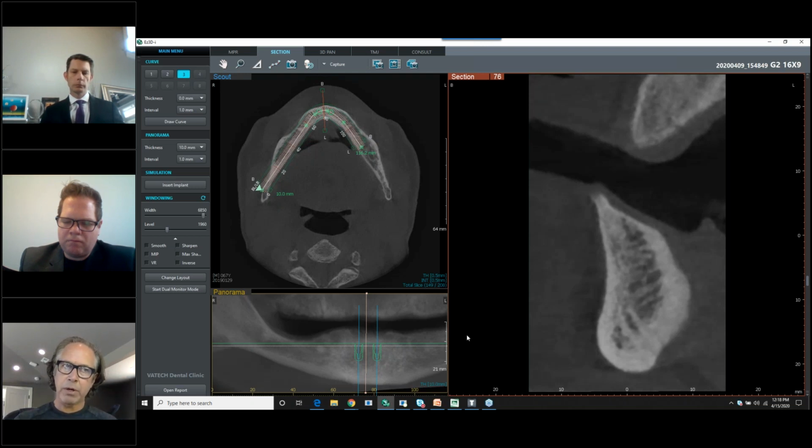I'm sure you have, because I have too, been in a situation where the patient says, Doc, when I bite here, it snaps up in the front, or if I bite in the back, this side, it snaps up on this side. There's a few things, but it mainly has to do with draw. So when you're looking at something like this, the idea about paralleling implants for path of insertion on anything that is removable is priceless.